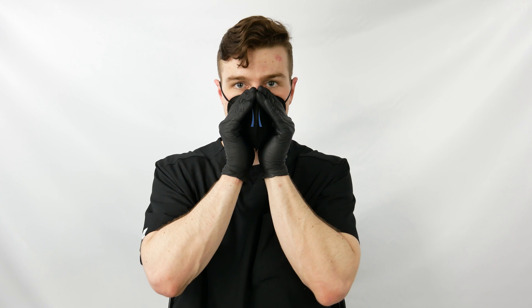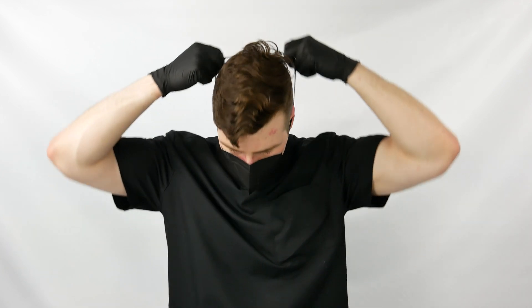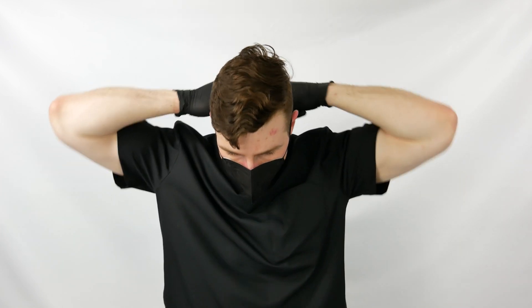Cup both hands over the mask and perform a seal check where you breathe in and out forcefully a few times. If there is leakage, you can readjust the mask and pinch the nose piece along the bridge of your nose.